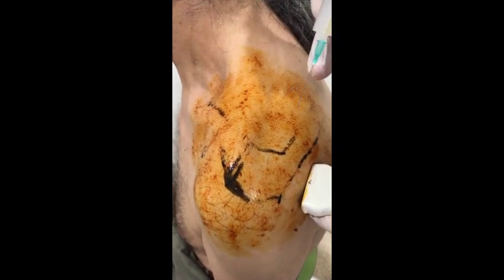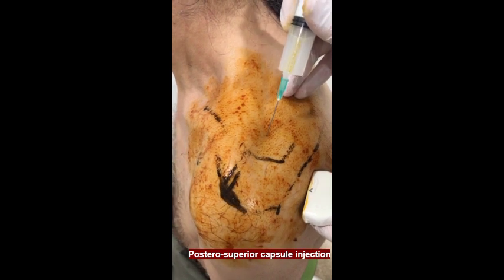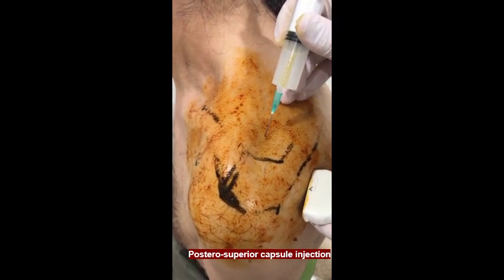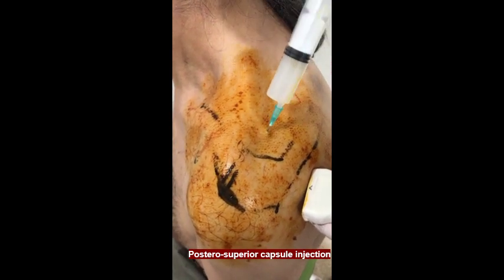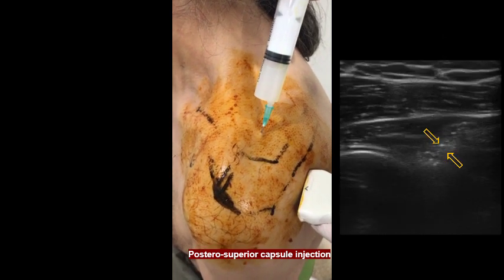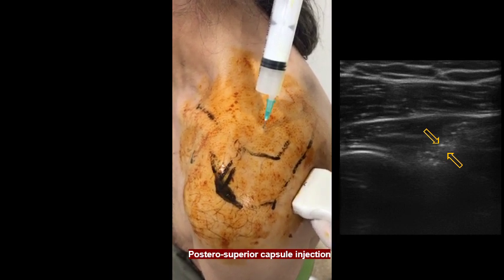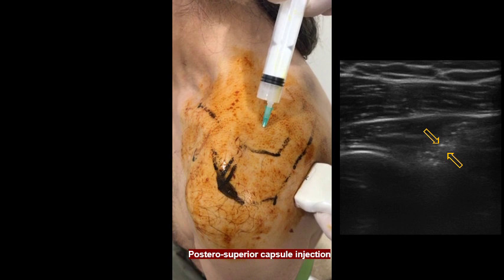After this, 10 ml of the drug combination is applied to the posterior-superior capsule from 2 cm cephalad to the midpoint of the spinoscapula, by directing the tip of the syringe from the supraspinatus fossa to the undersurface of the acromion, while the joint capsule is screened posteriorly by the transducer.